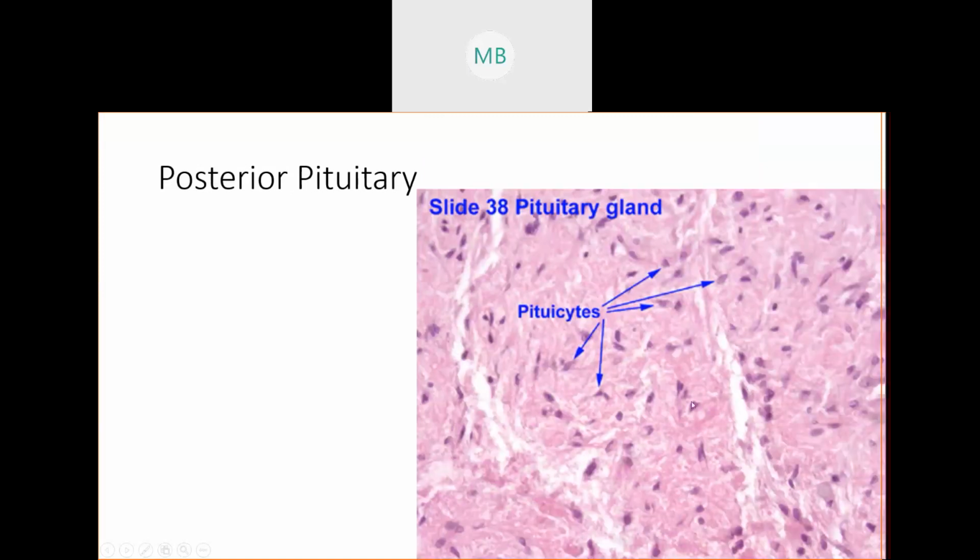Okay. When we zoom in on your posterior pituitary gland, nobody was creative when they thought of this name. Each of these individual little cells here, you can see the nucleus and then you can see the rest of the cell outlining them. Cyte is your Latin term for cell, and pitu is short for your pituitary gland. So literally, the cells you're looking at here from your posterior pituitary can all be summarized as pituicytes, which literally translates to cells of the pituitary.